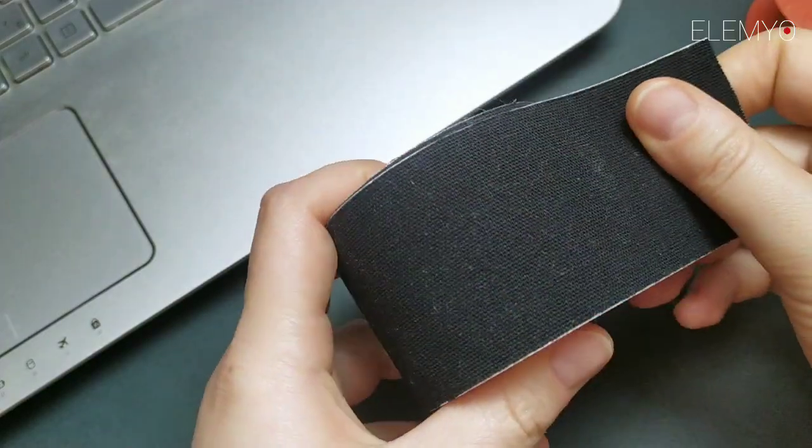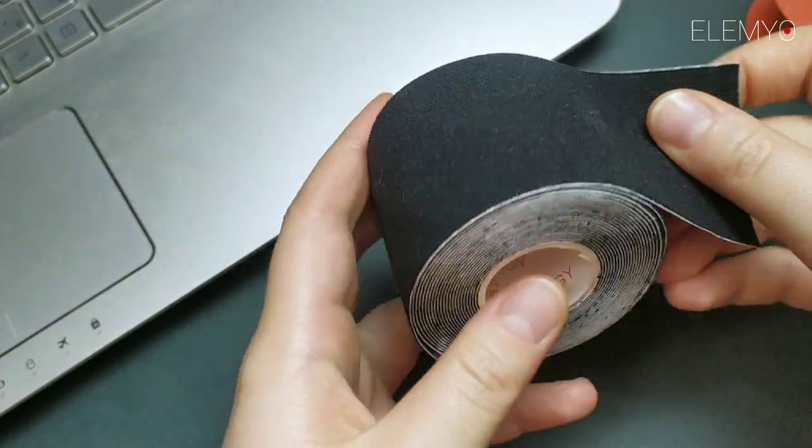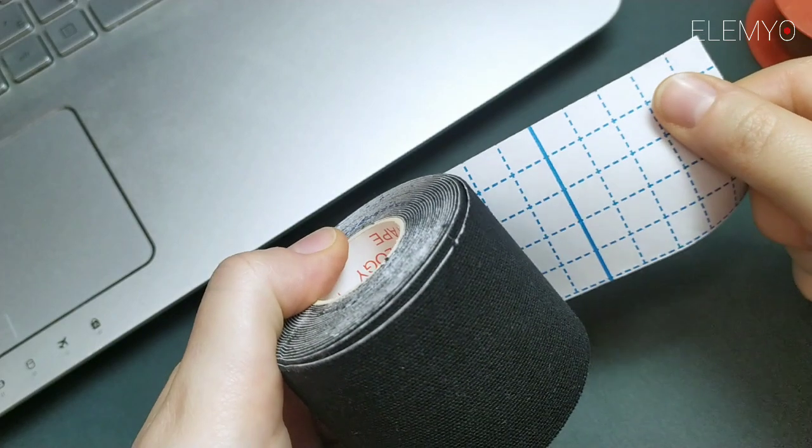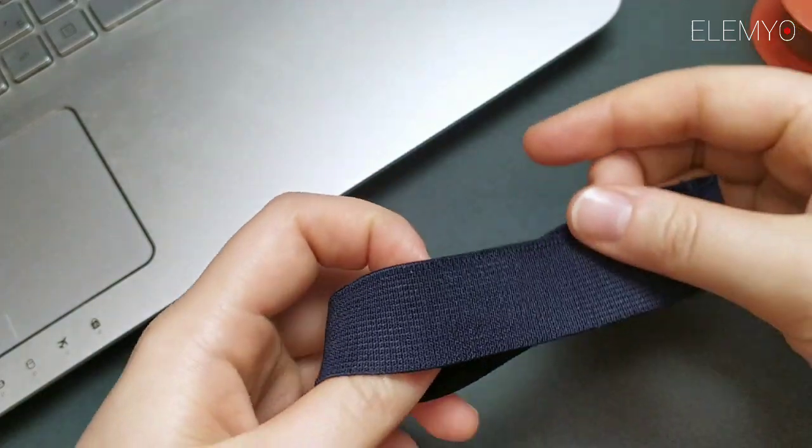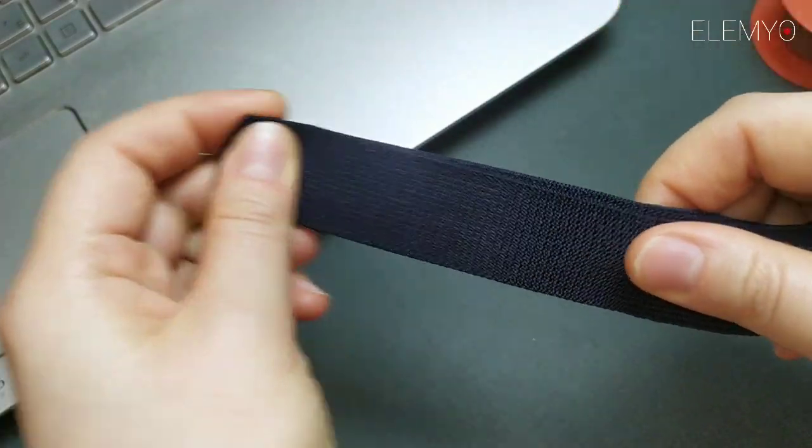For placing the sensor on skin, you can also use sport tape. For arm and legs, you can use an elastic band. Just put it on your limb and place the sensor under it.